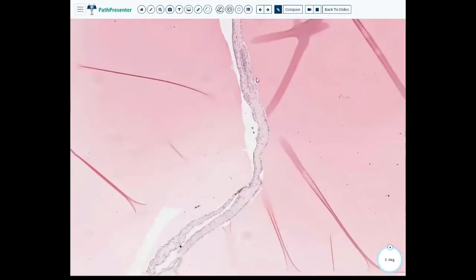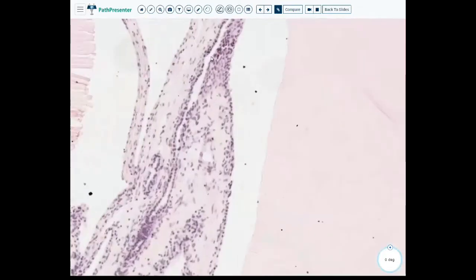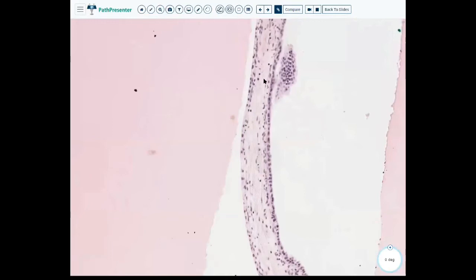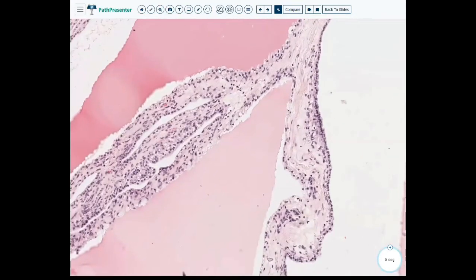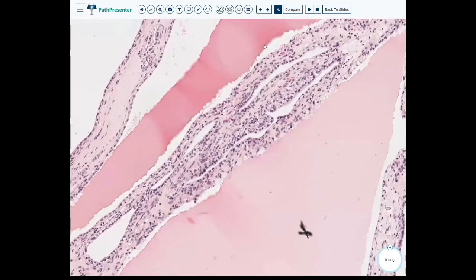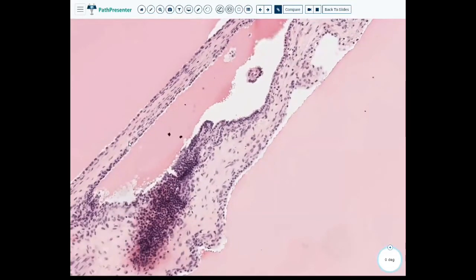There's not a whole lot of cells to look at in this case, even though it's a big slide, because again, it's a single layer of neoplastic cells. Again, some more beautiful hobnailing where you can see it imparted in the serum, because this looks like serum.